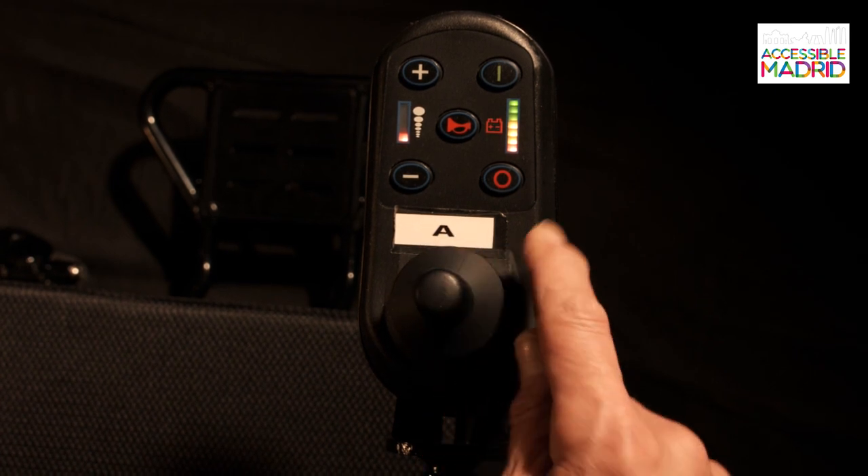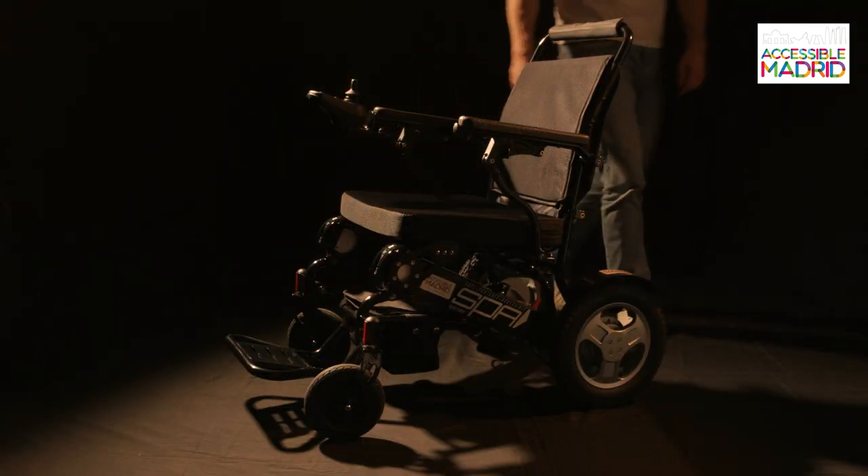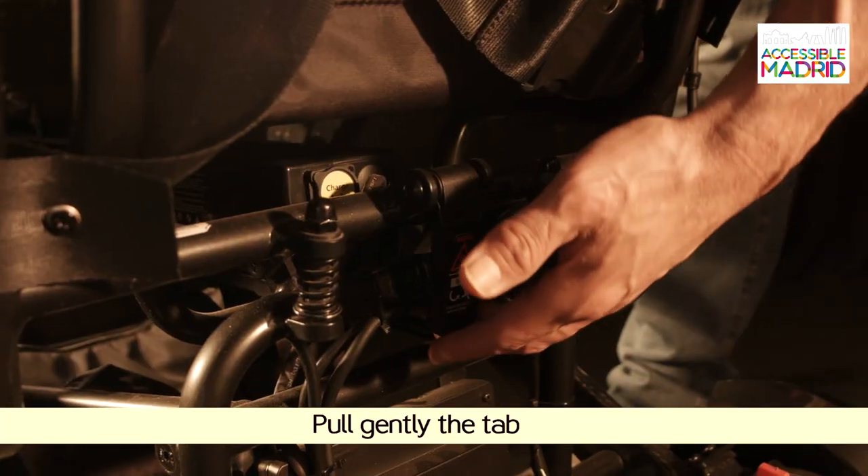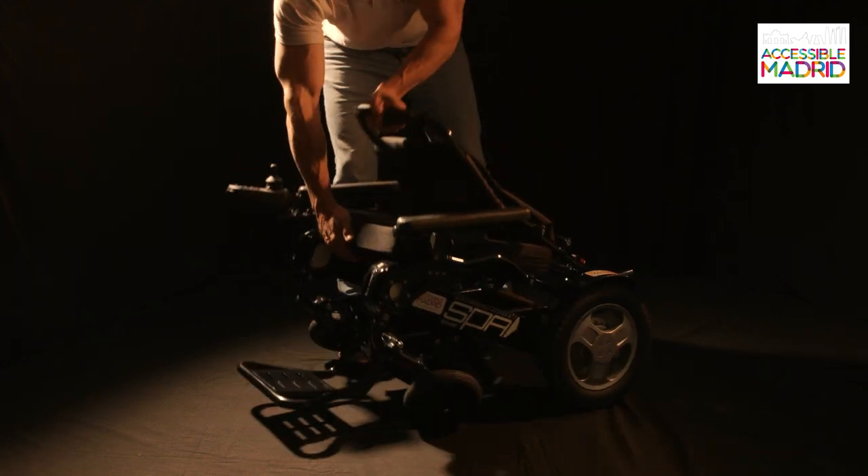To fold the chair, we will first turn it off. Gently pulling the tab behind the backrest will unlock the chair for folding. Simply apply pressure to fold the chair.